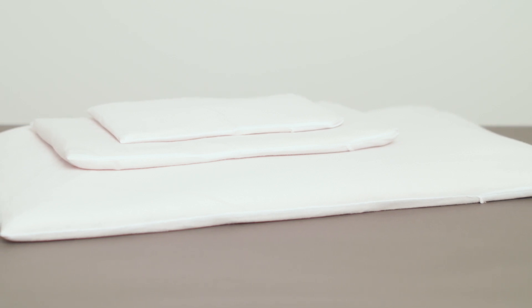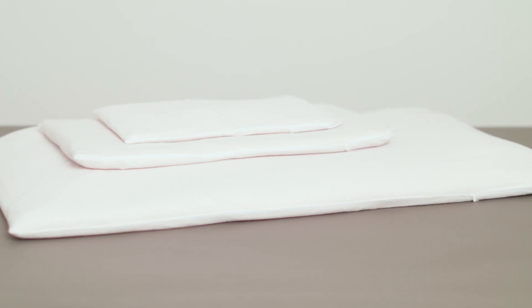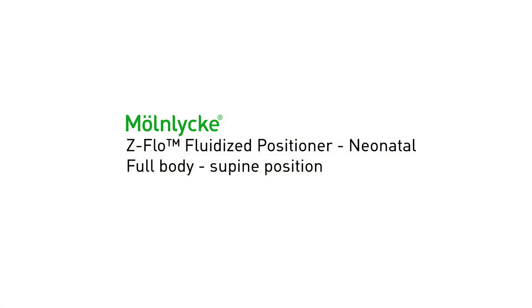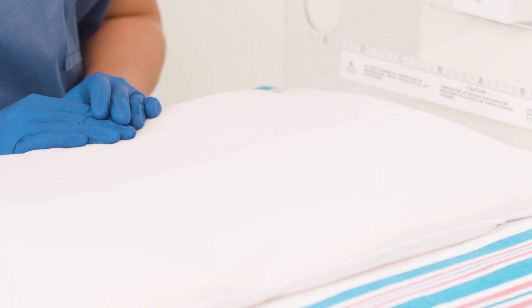The full body positioner comes in multiple sizes and an appropriate size should be chosen to support each patient individually. Begin with the positioner flat and inside the cover. Straps are attached to the positioner cover to ensure easy access when needed.